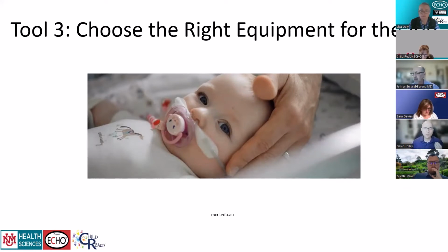because while we're talking about intubation, I want to stress that we use the least invasive method necessary to care for the child. So any child that can make noise while they're coughing, or if they're able to speak or cry, they let you know they're getting air in and out. If they're awake enough to be afraid of you, that means you're getting enough oxygen to their brain. So depending on the disease that's causing their emergency, you might be able to get along with a simple nasal cannula, non-rebreather treatment, or a high flow nasal cannula, which is shown here. So even in situations where you have a child with severe asthma, severe bronchiolitis, or even severe DKA, a lot of times we will do our best to get away without intubating the patient.